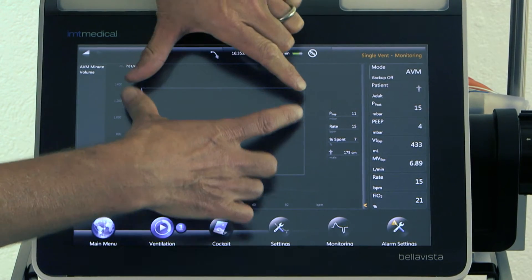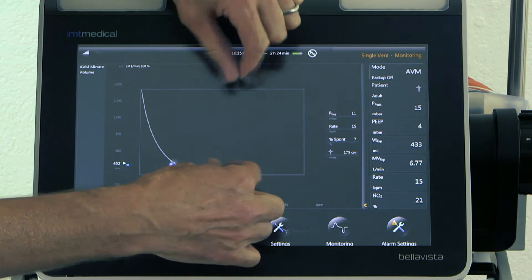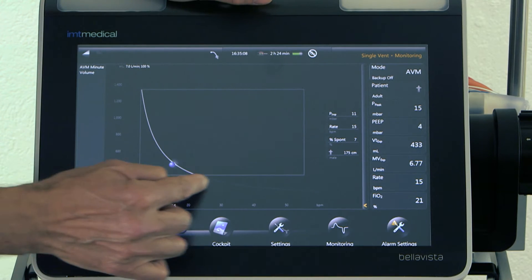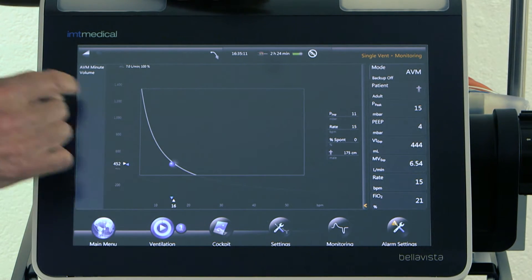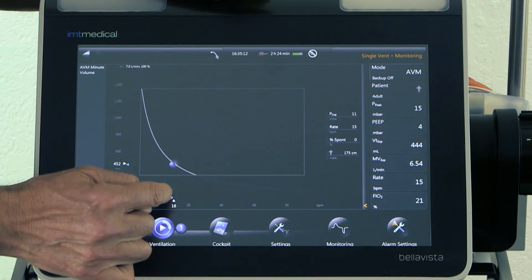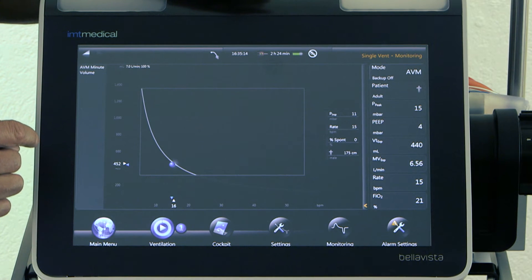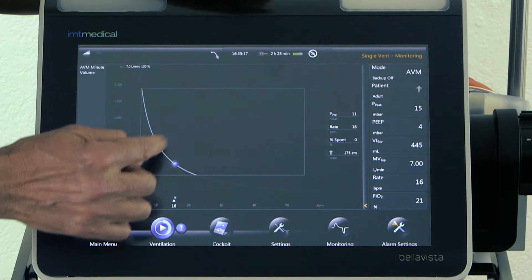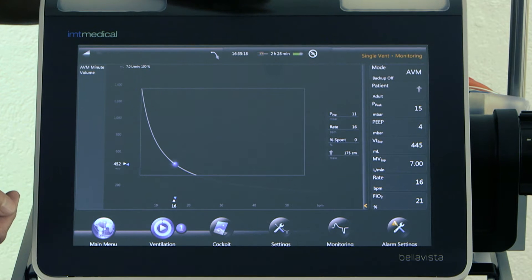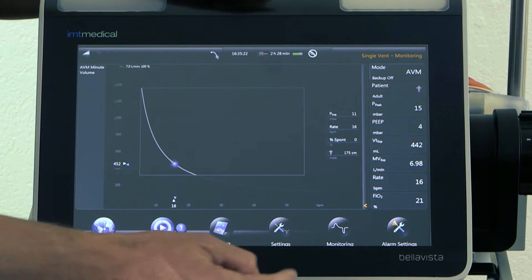However, for this patient there is a safe zone inside this rectangle, and there is a working point — an ideal rate and an ideal tidal volume. After about one minute, the adaptive ventilation mode has now reached the working point.